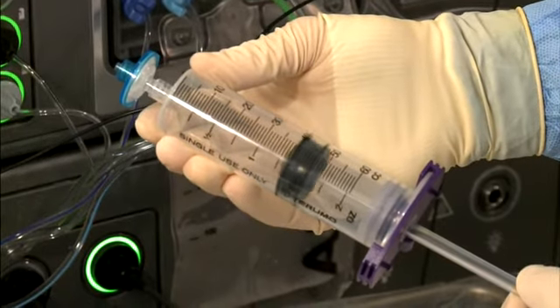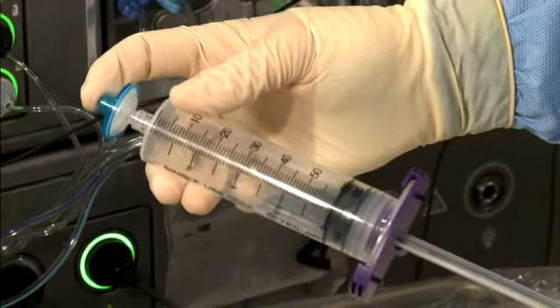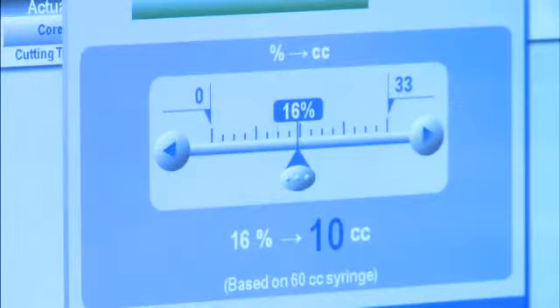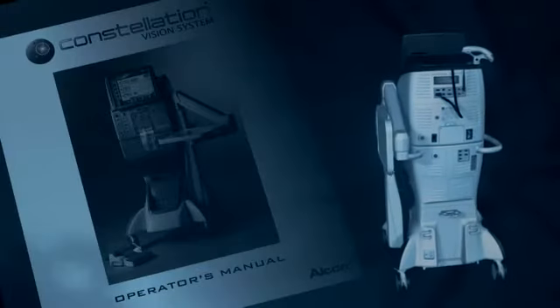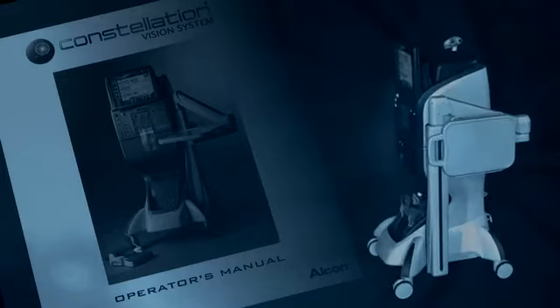The embedded calculator can be used to determine the mix ratio for the desired proportion of air to gas. For example, if a 16% gas-air ratio is desired, then 10 cc's of pure gas would need to be in the syringe before mixing with air. Use the markings on the syringe body to help confirm the proper mix ratio. For more detailed instructions, please consult the operator's manual or the directions for use.